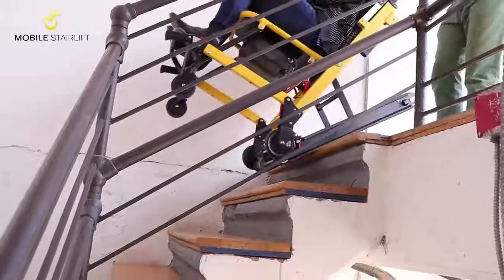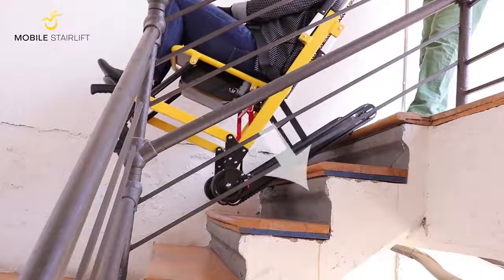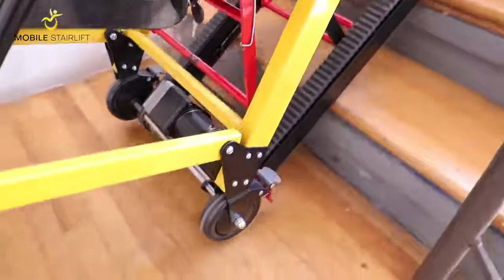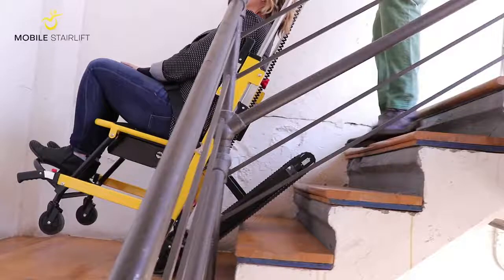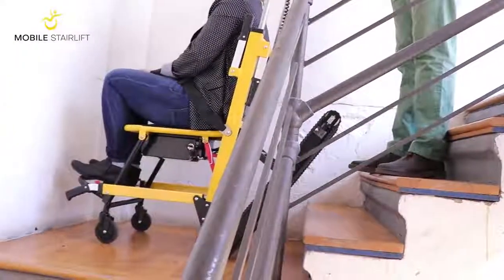Take care to pull the handlebar towards the stairs to keep the tracks pressed flush against the stairs. You should not be holding the weight of the stair lift in your hands. Once the back wheels of the stair lift touch the surface at the bottom of the stairs, use the handlebar to tilt the stair lift forward into an upright position.